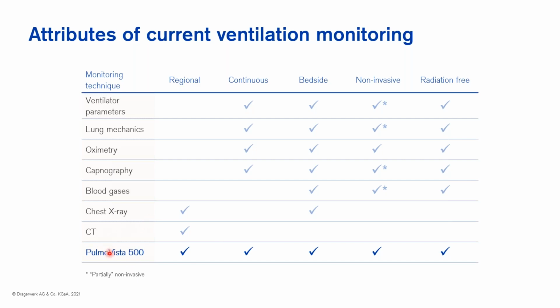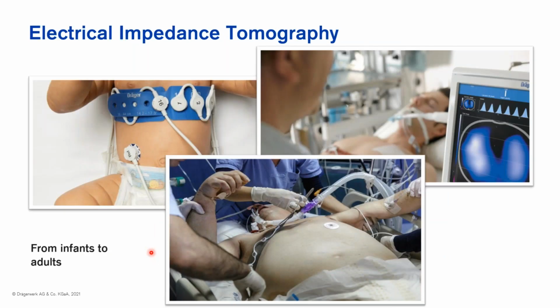And I want to say very clearly, of course, PulmoVista and EIT can never replace any of these other modalities. It is something which is completing the picture to give us the necessary information that we need right at the bedside, or right at the OR table, to make an informed decision on what might be the optimal settings for this patient.